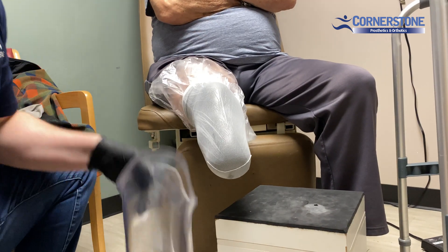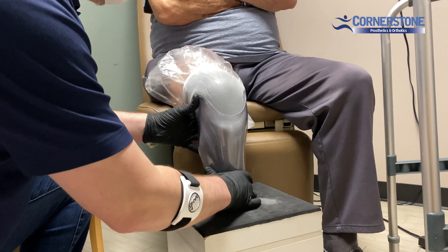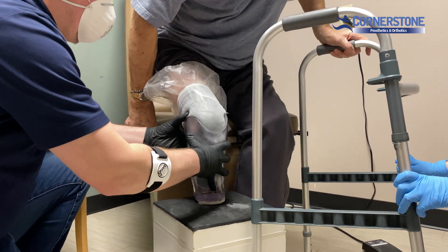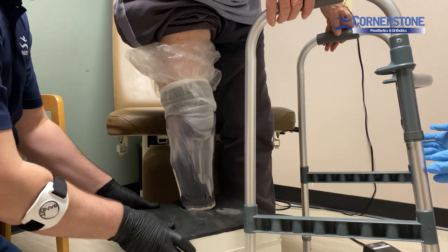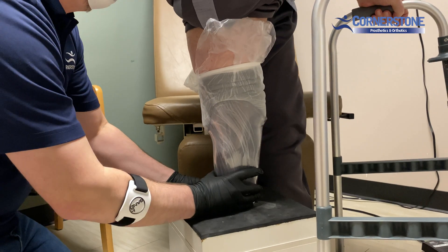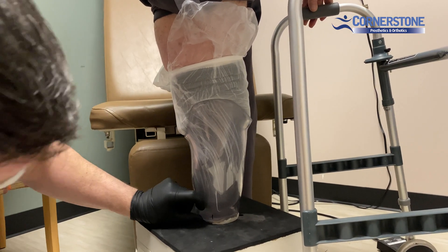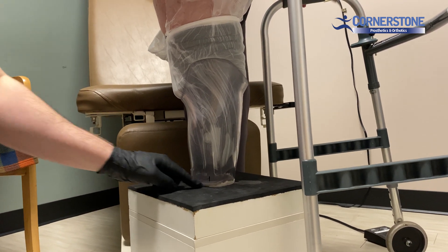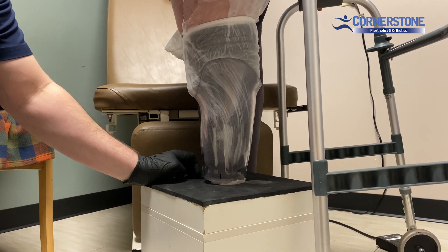Once we have this ready, we're going to go ahead and put the socket on, then ask the patient to stand up and allow them to fully seat down into the socket. As you can see, we have the space at the bottom for the thickness of the gel we want in there — about a quarter inch to three-eighths inch of gel, maybe even up to a half inch. The more silicone you get in there, the heavier it's going to be.